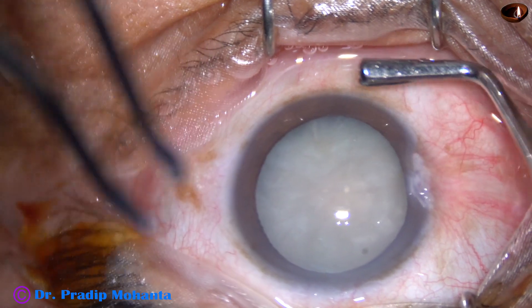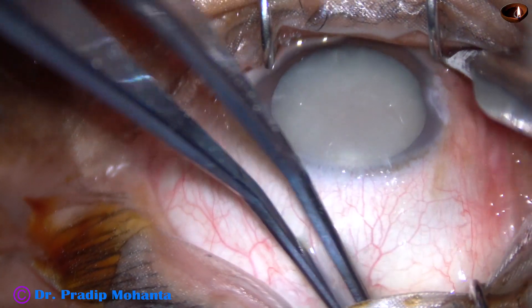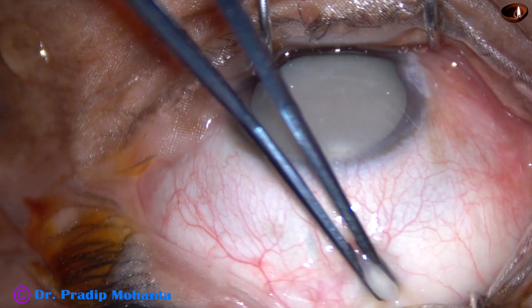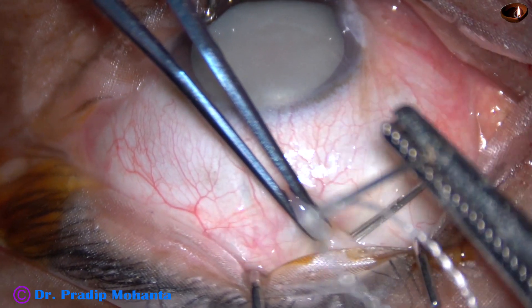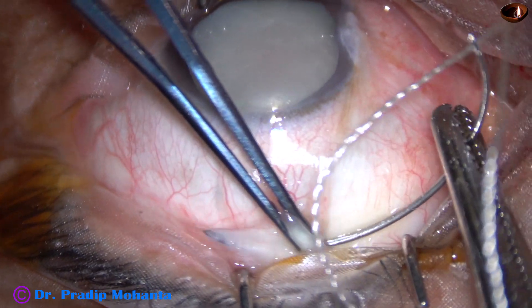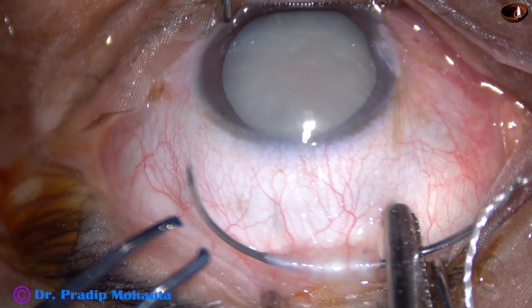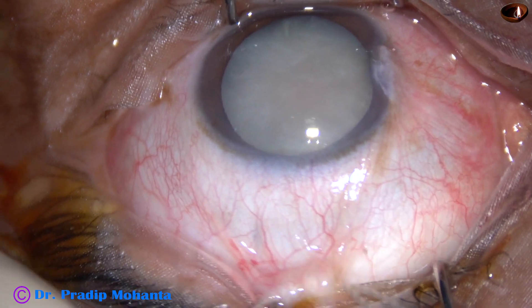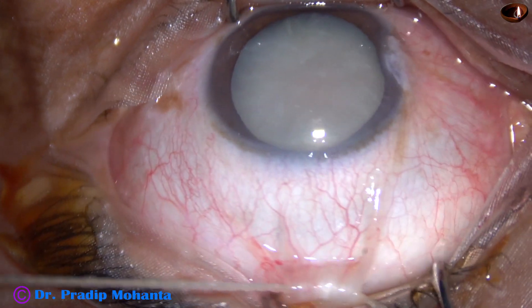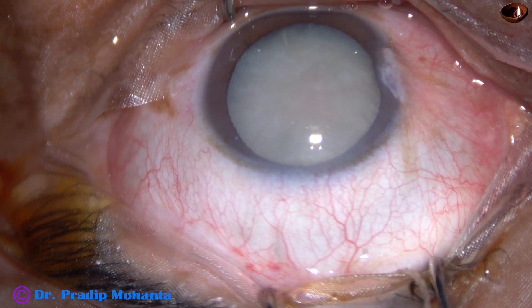First thing is put a superior rectus bridal suture. This is very important for beginners. Hold the superior rectus tendon nicely and pass a thick autoclaved nylon suture beneath the superior rectus tendon. Once this is done, pull the superior rectus tendon and stabilize the eyeball.